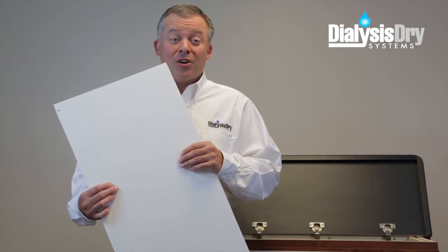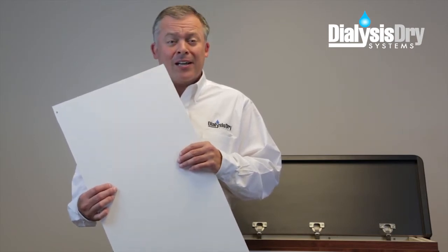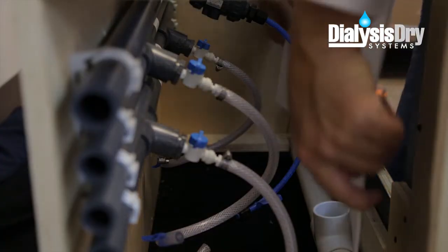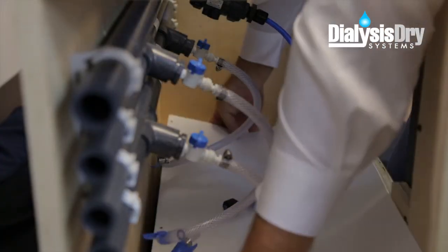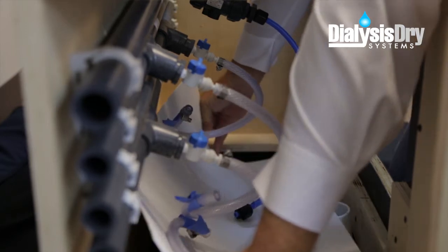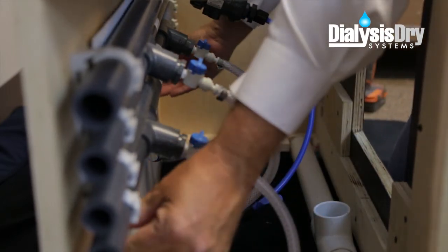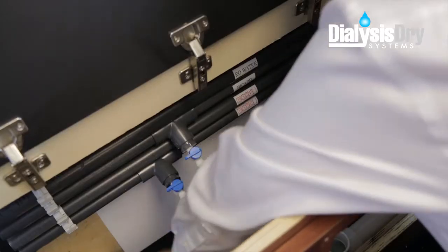Next, we will install the supplied reinforced panel. The panel should be installed with the textured side facing out. Start by inserting it horizontally through the opening at the top of the cabinet. Then, curl the panel when it reaches the bottom, and slide it behind the distribution piping located on the back side of the cabinet.